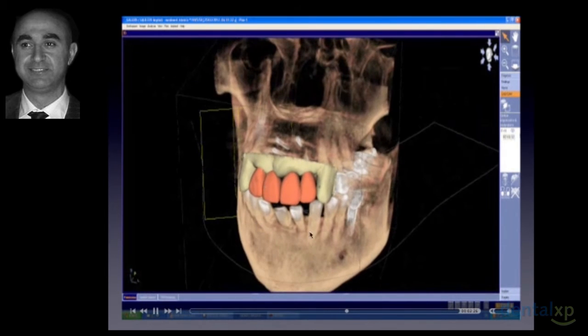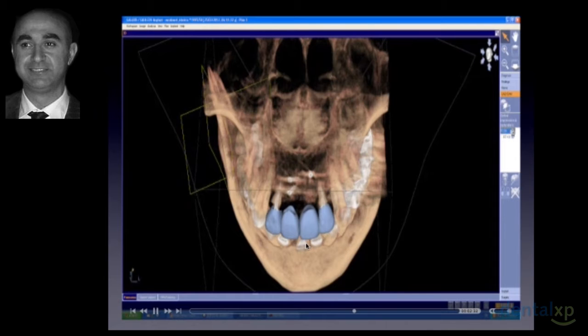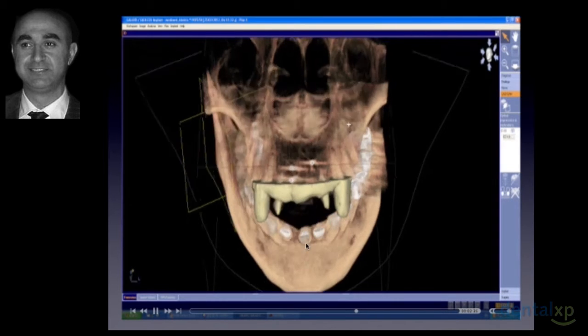Forget about the lower, because these lowers are planned to be extracted, and placing implants to re-angulate the proper labial inclination more into a lingual inclination.